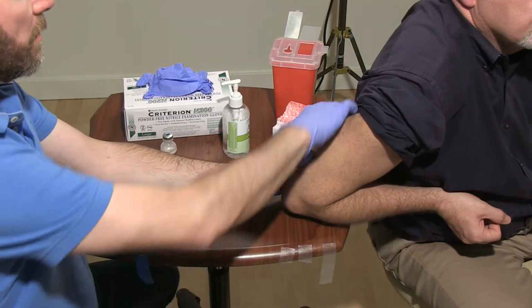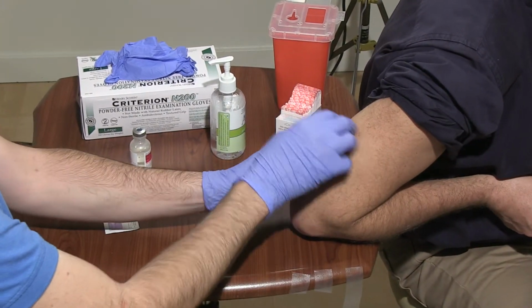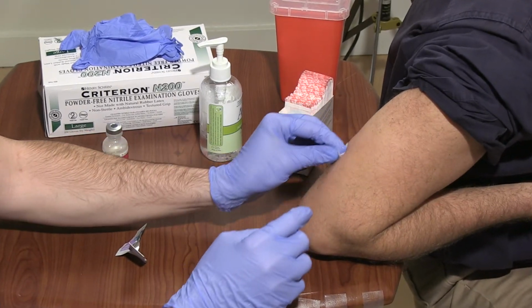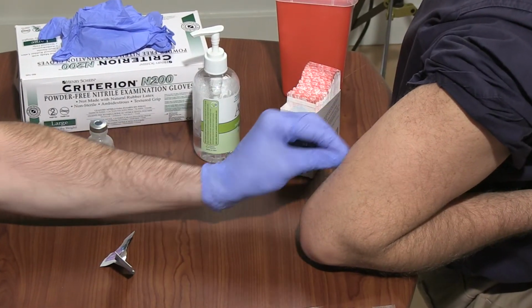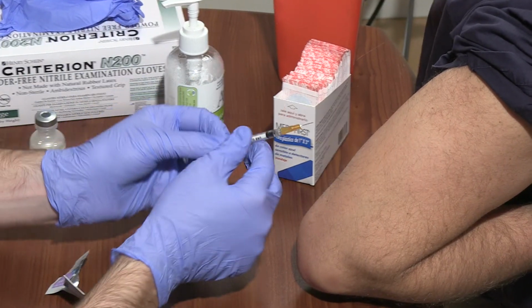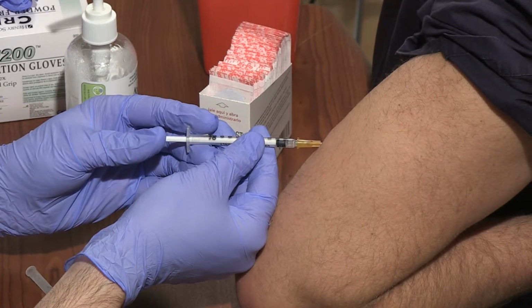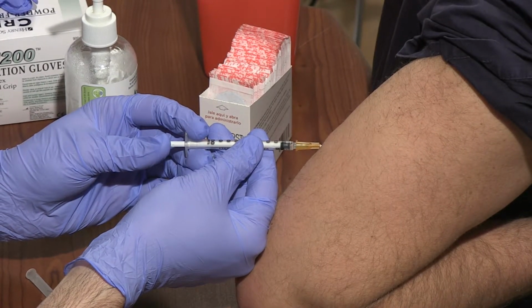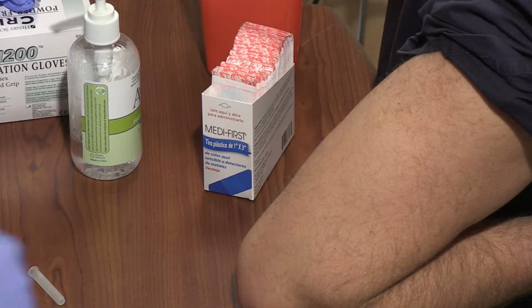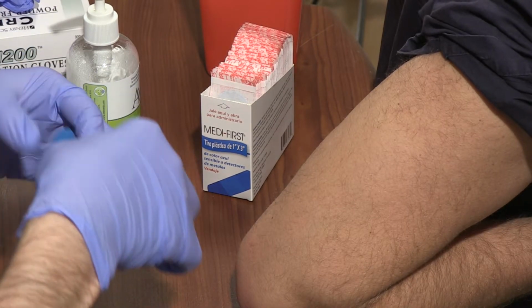Feel for the back of the arm. Okay. Inject. Alcohol wipe. Circular motion. Outwards. 45 degrees all the way in. All right. Shot container, and they're ready prepared.